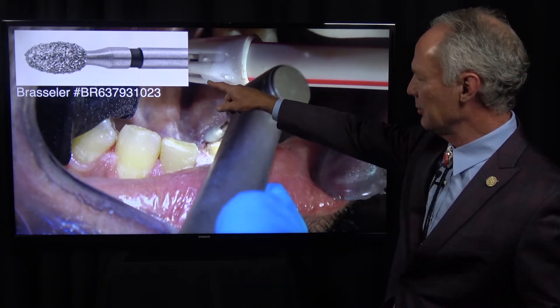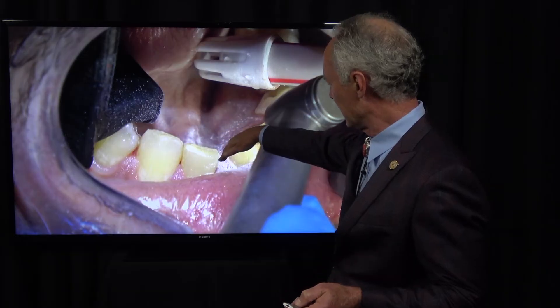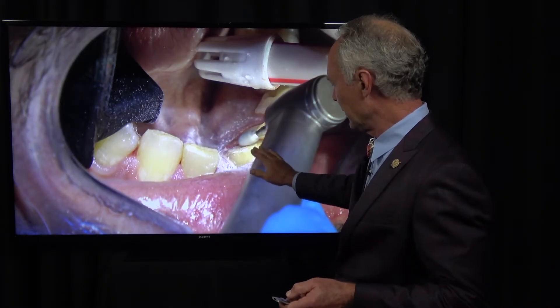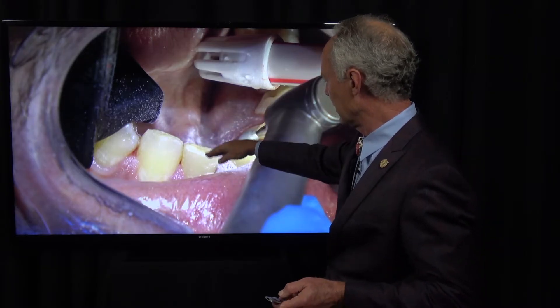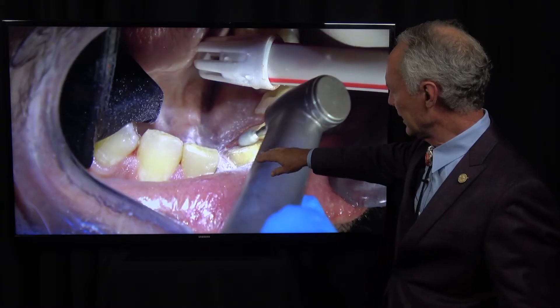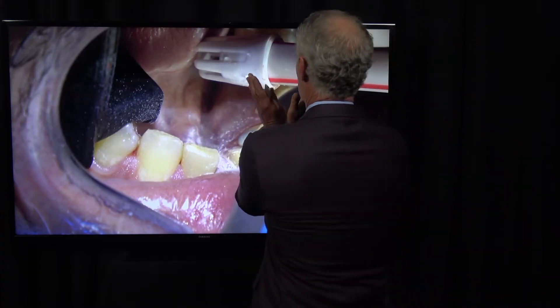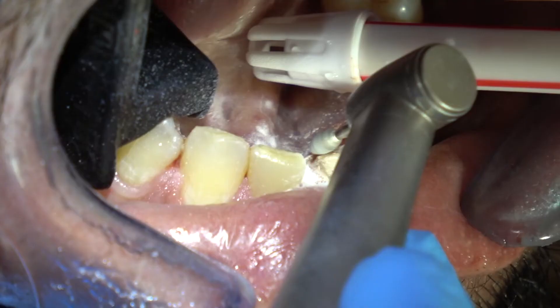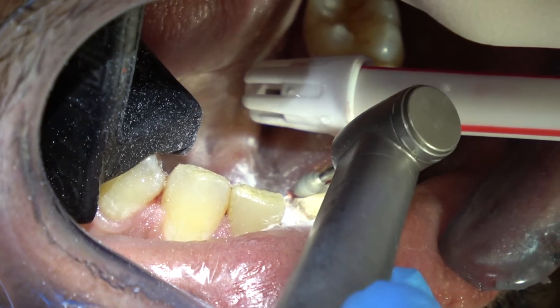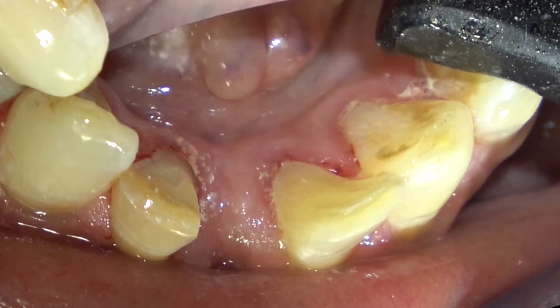Now I'm prepping the lingual with a coarse football diamond. You always want that surface to be concave, not convex. I'm not doing much preparation at all - I don't care if it's a little bulky on the lingual. I don't want to prep through the enamel because you have greater bond strength when bonding to enamel than to dentin. So I want to keep the preps in enamel. Be sure these interproximals will draw - you'd rather over-prep a little than under-prep. Just freshening that surface is essentially all we're doing.